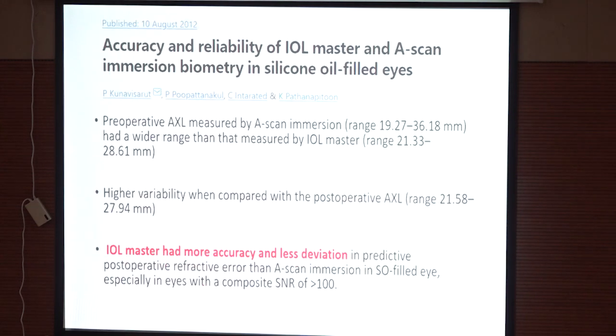But studies have been done to compare the IOL master and the A scan biometry in silicon oil filled eyes, and they have found that the IOL master overall has more accuracy and less deviation in predicting the post-operative refractive errors. So if you have the option of IOL master, it's preferred to take that.